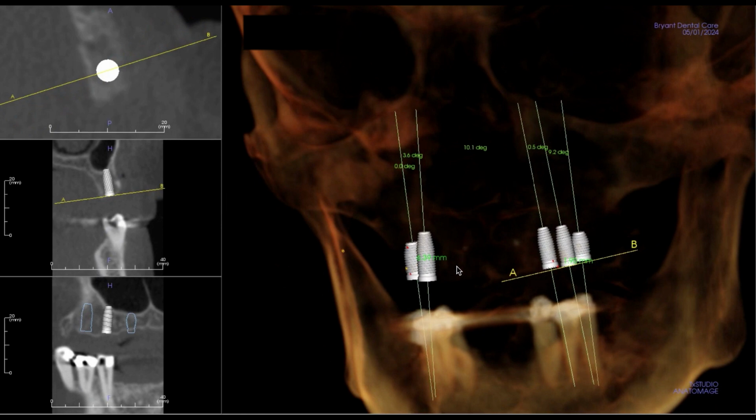So the patient doesn't like the palate of her denture. She had her teeth removed a year or two ago, and then the denture's been in, and she's been miserable since. So she's ready to take the jump. We did a full review of Form 17, and then we came up with a conventional overdenture.